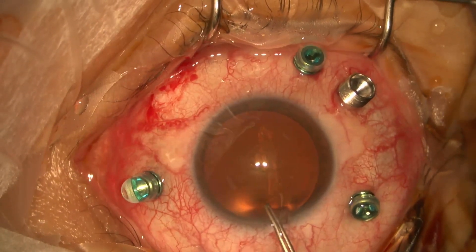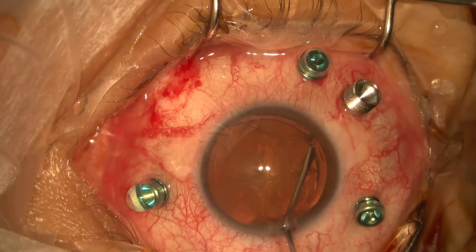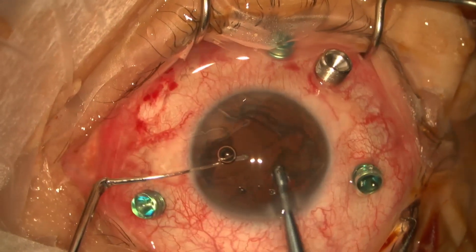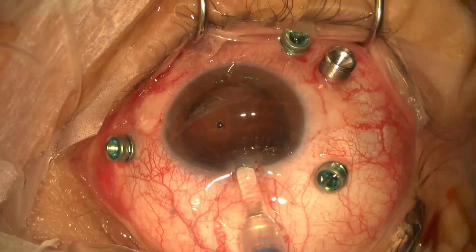This is the case of a fresh retinal detachment in a 59-year-old man who presents two retinal tears, one of which is very large.